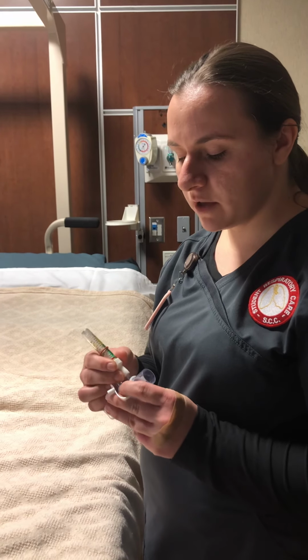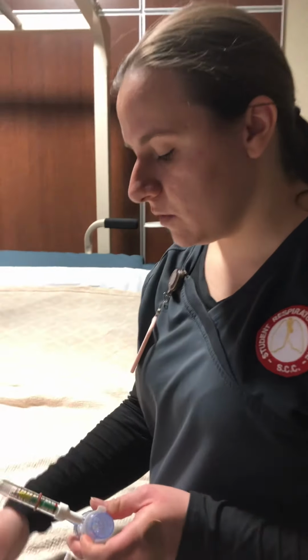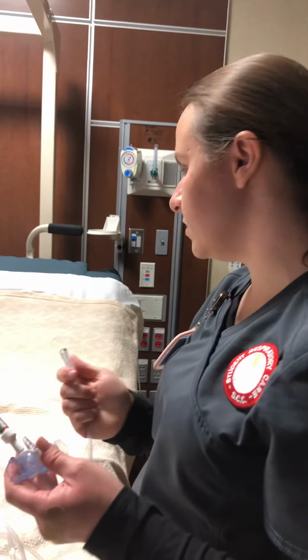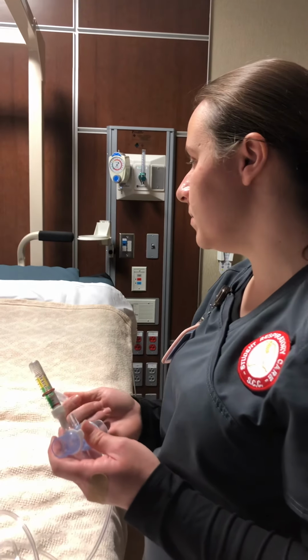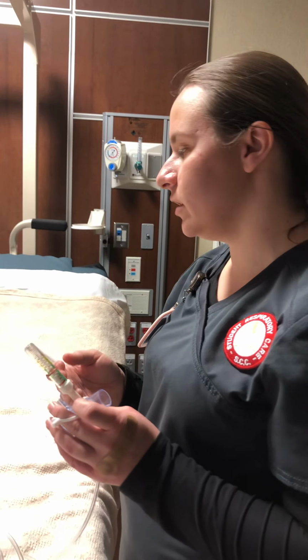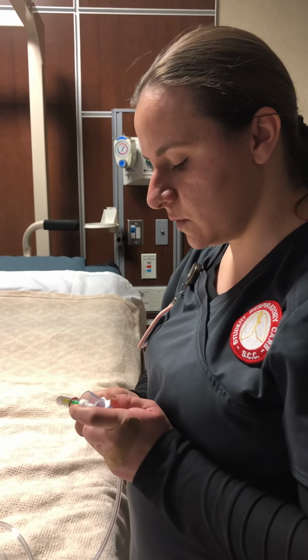So what I'm going to do is apply it to the little port here. And then I'm going to set it at kind of where I like them to be when they do it. With the EZ PAP, it will be connected to an oxygen source, so you'll hear some noise when you do this treatment, but don't worry, it's nothing that will harm you with the oxygen. It's a positive pressure flow. So this is just going to help you, it's an easier breathing treatment for you. That way you don't have to do as much effort as when you're doing the other ones, okay?